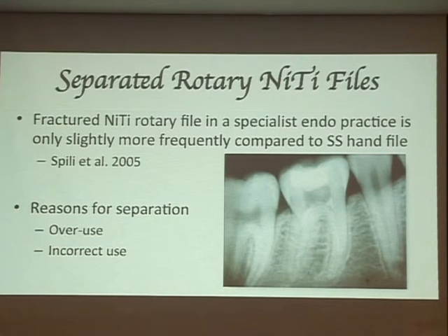Okay? So a lot of people now are starting to use them. In the UK, there's a new law: all endo files need to be single use because of mad cow disease. Australia is coming, as far as I know. So I see the trend is that most files should be single use. Check your file, measure the length. It's either 21 or 25, right?